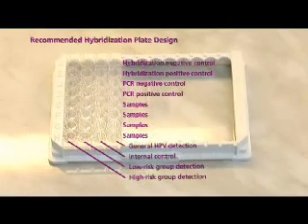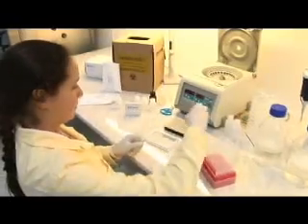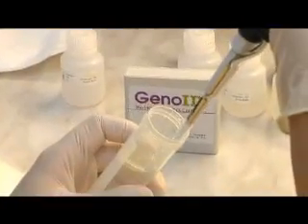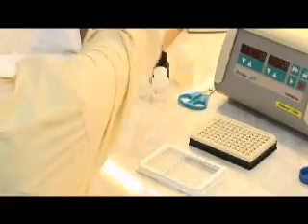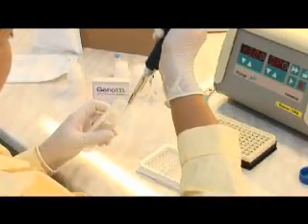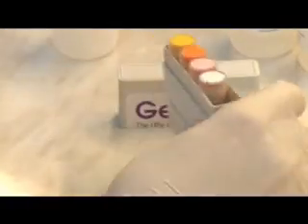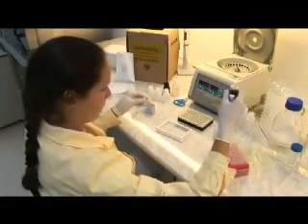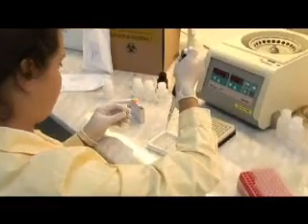The best practice is to follow the recommended hybridization plate design with controls and specimens. Add the diluted specimens to the wells. Then add DNA-free water as a hybridization negative control to minimize the risk of contamination. This is followed by the hybridization positive control, which is a mixture of HPV high risk, low risk, and IC hybridization positive control mix.